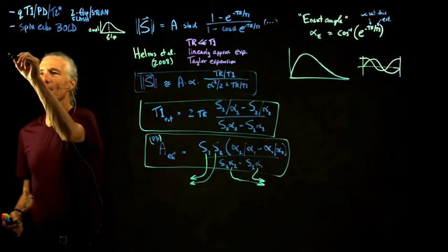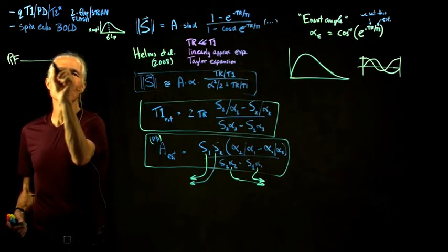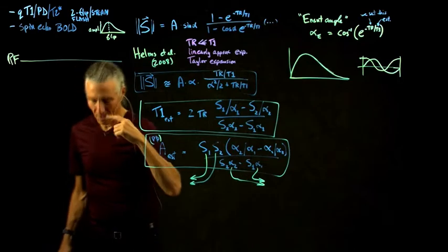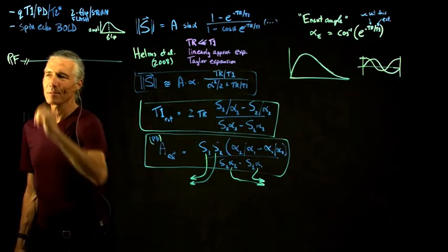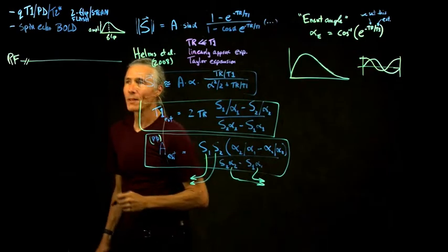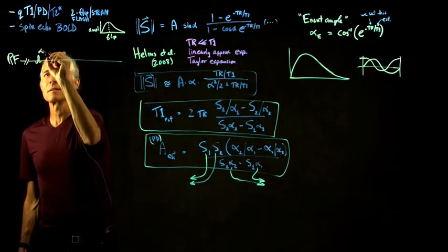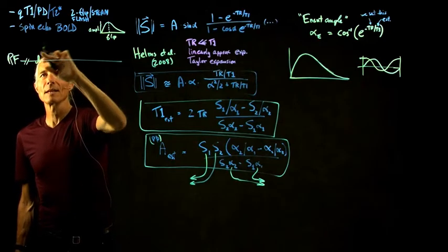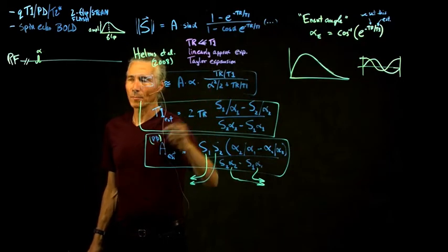One advantage of that is that it's the fastest possible data collection. There are no gaps. It just fires away, continuously collecting data as fast as you can. So how does it work? You do a small flip angle. It could be either a slightly bigger one or a slightly smaller one, because we need 2 different flip angles.